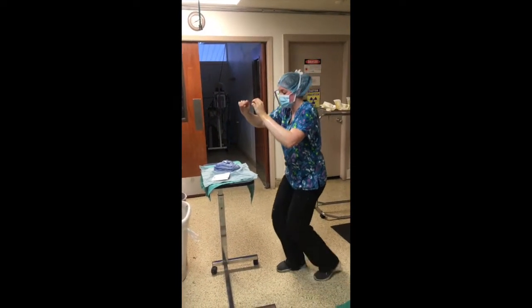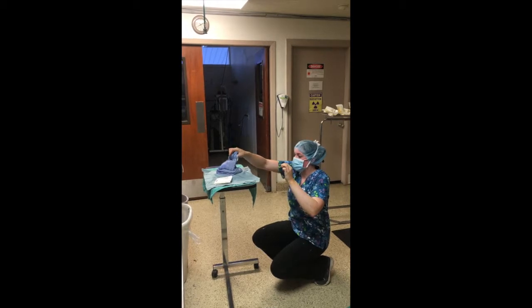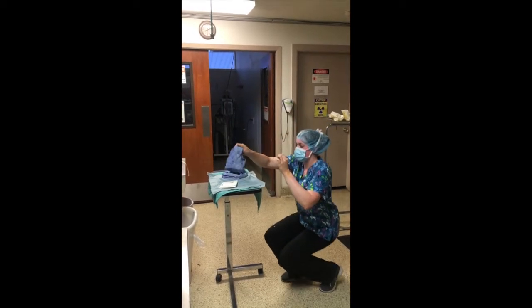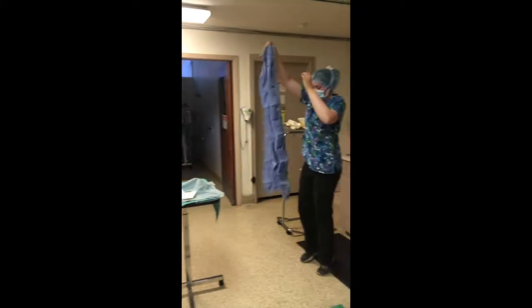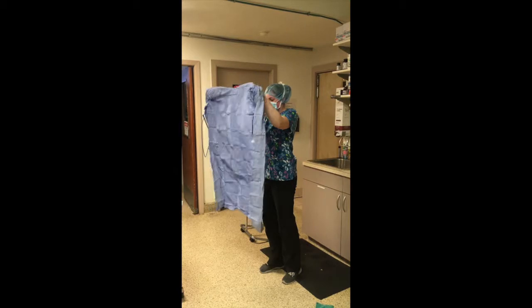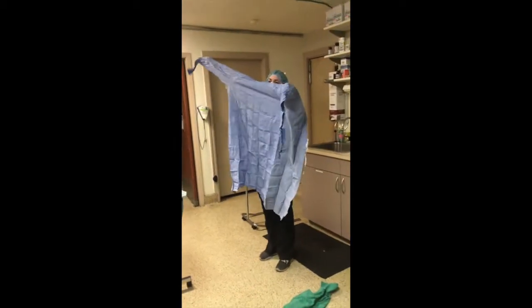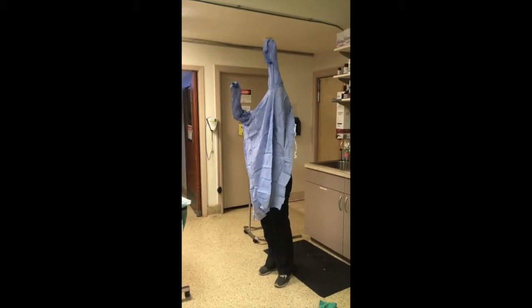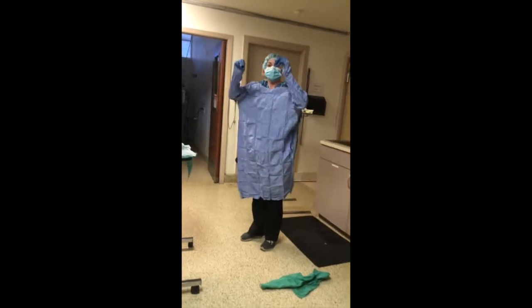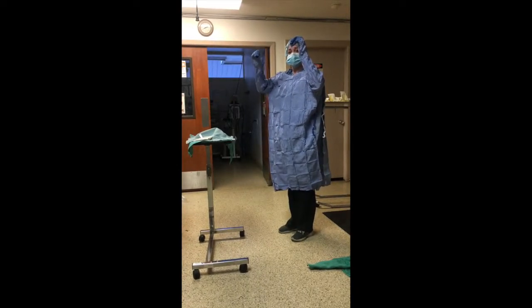It's time to gown. So what I'm going to go ahead and do, making sure my hands do not drop beneath my elbows, I'm going to make sure that I grab my gown. I'm going to go ahead and pull it straight up. Straight up. Once that's done, I'm going to go ahead and open up my gown. Put my gown on. Alright, I don't want my hands to come out of the gloves, or the gown. So now my assistant is going to come tie me in. And my indicator strip was sterile, so this gown is sterile.